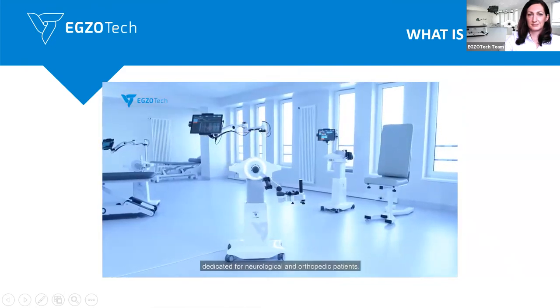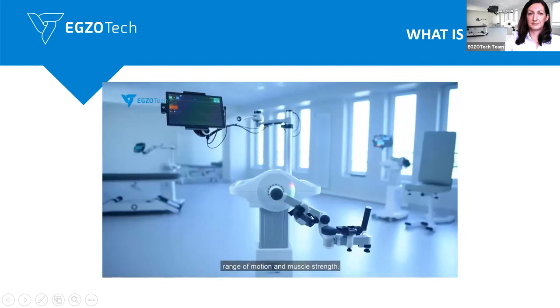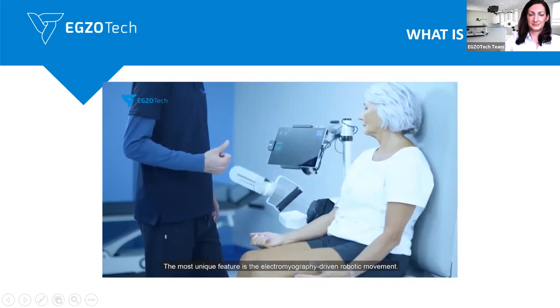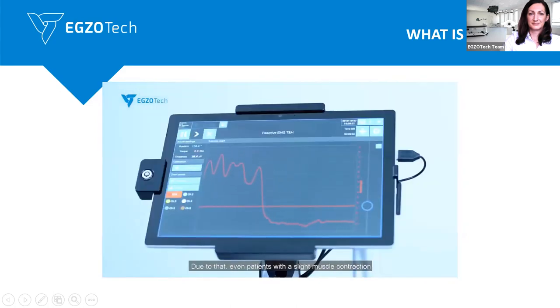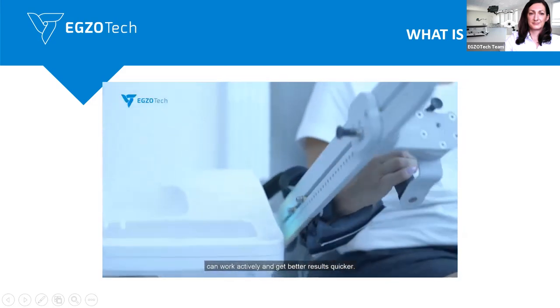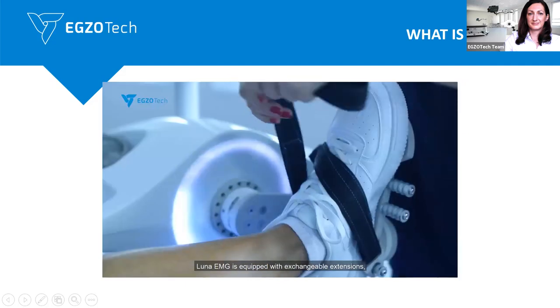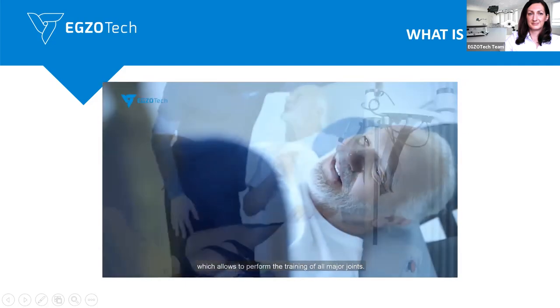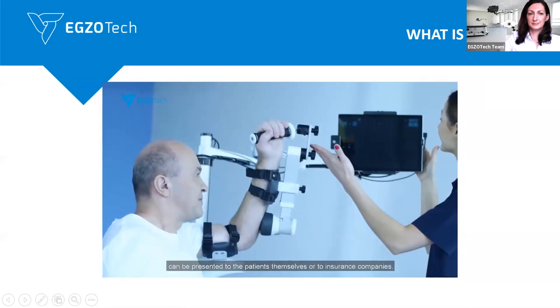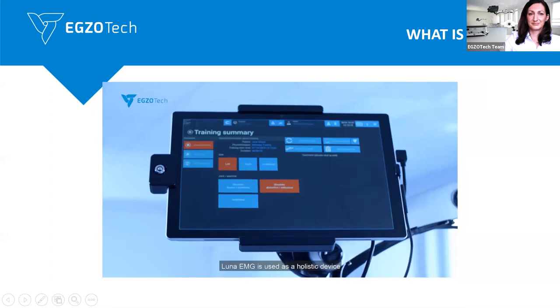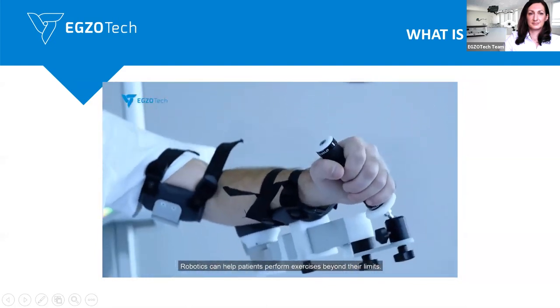Luna EMG is a robotic device dedicated for neurological and orthopedic patients. It is used as a tool to improve neuromuscular coordination, range of motion, and muscle strength. The most unique feature is the electromyography-driven robotic movement: the robot detects muscle activity and assists with motion if patients exceed the threshold line. Even patients with slight muscle contraction can work actively and get better results quicker. Luna EMG is equipped with exchangeable extensions to train all major joints, and includes games to engage patients. All data and reports are stored in the system. Luna EMG is used as a holistic device with passive, active, and active-assistive training.